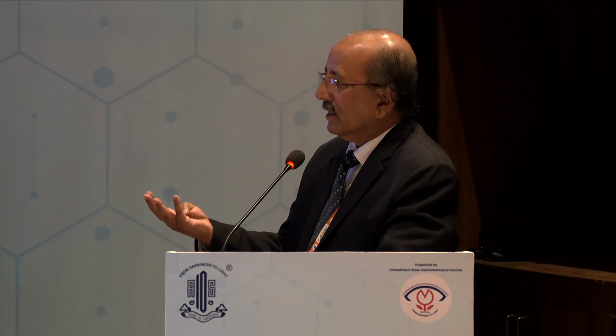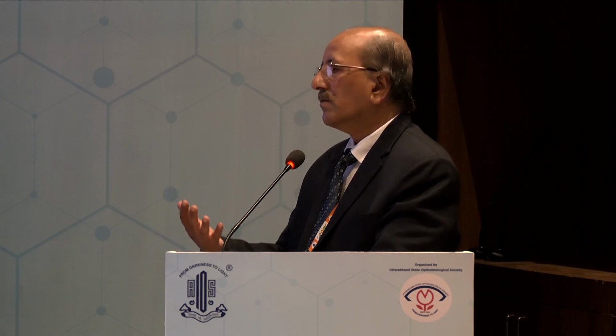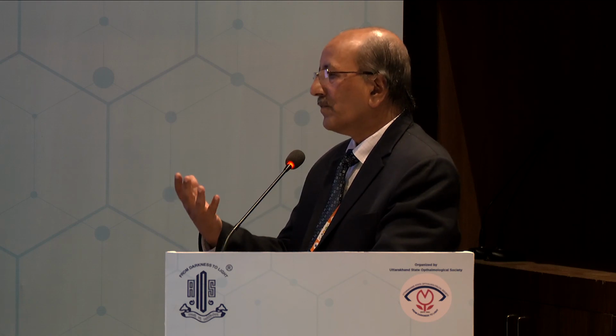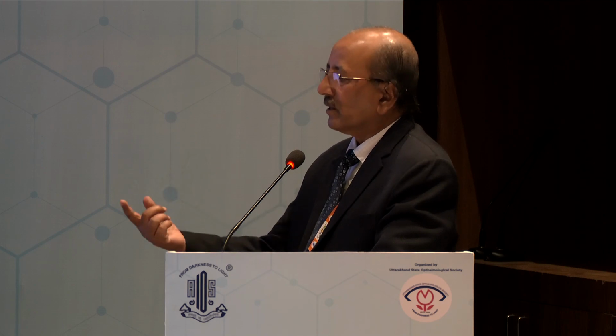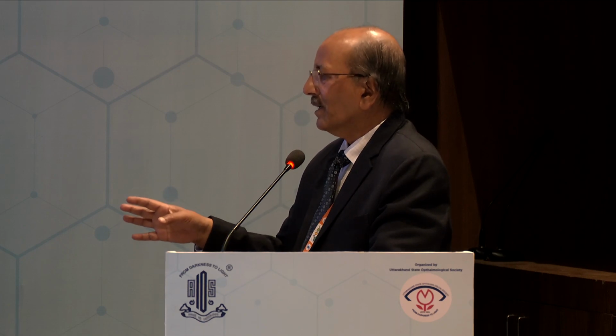Posterior optic capture. Most commonly I do in the bag implantation of the IOL. That is number one. Almost 85 to 90% I do in the bag. Sometimes there is optic capture, of 2 types. One I am talking about is posterior optic capture. Posterior capture means your IOL haptics are in the bag and the optic is behind, in the posterior capsule. The anterior one I do less than 1% or so.